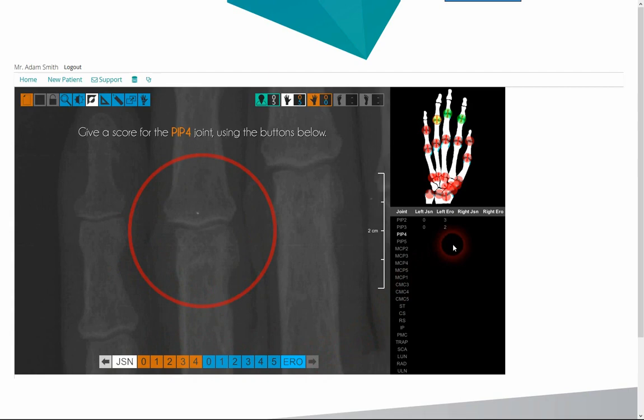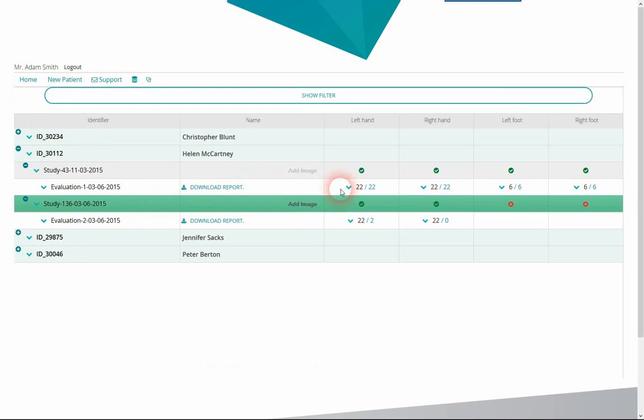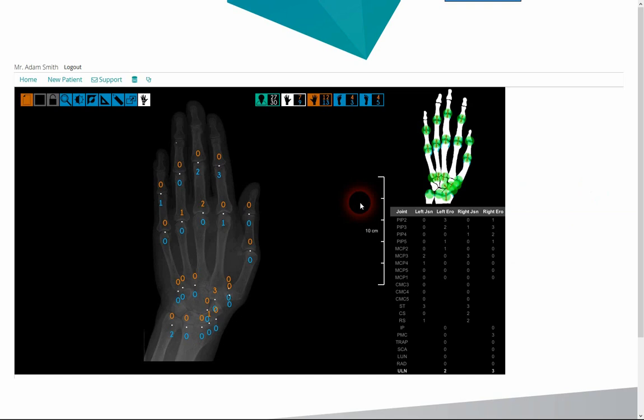The chart on the right side tracks the scoring progress and the scores already given. In the record manager, we can check already evaluated images and load new ones. In this case, we select the review of a scored image containing four limbs.